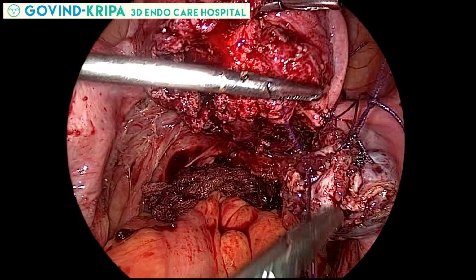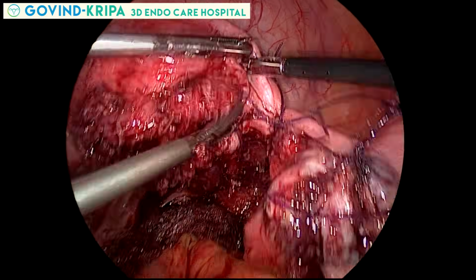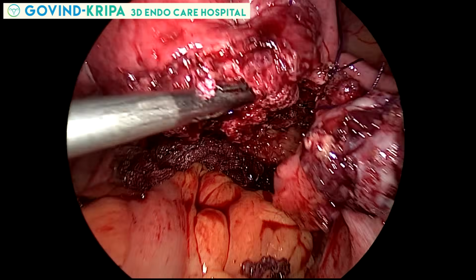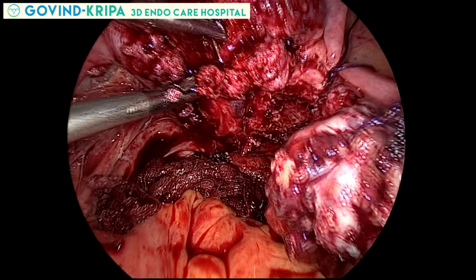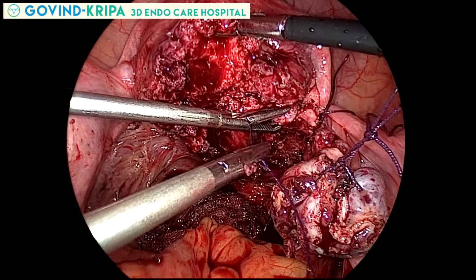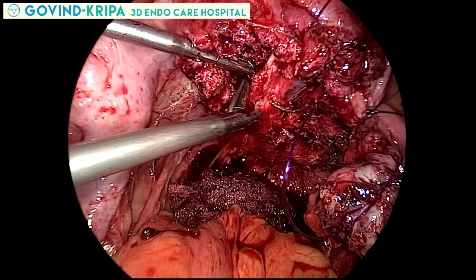For this adenomyoma suturing, barb suture is used in a particular manner. And once one flap is sutured, the second flap is taken and overlapping is achieved. This overlapping provides better strength to the wound and better healing, and it decreases the chances of uterine rupture in the future pregnancy.